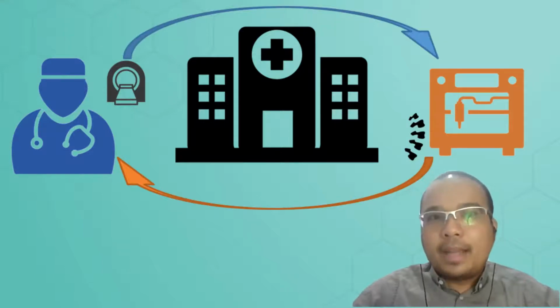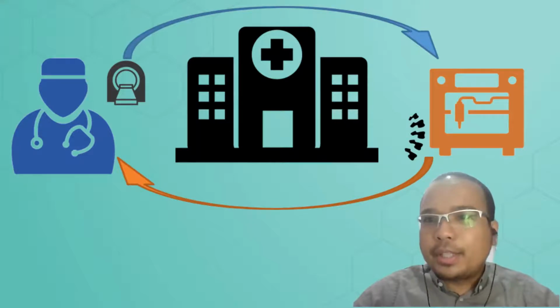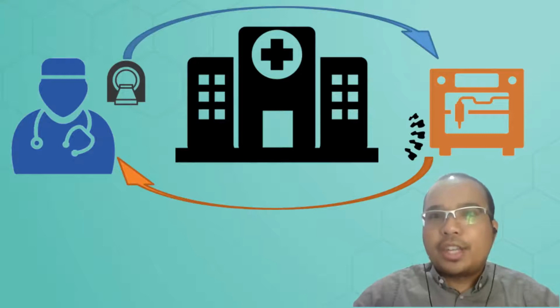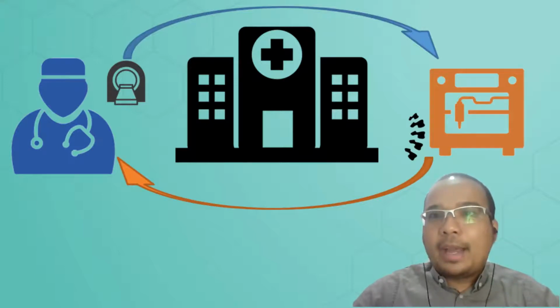Segment this on whatever the doctor wants, bones, tissues, skin, and manipulate this, prepare this to be 3D printed so that the doctor can just use the 3D printer on its own and come up with the anatomical model that he or she can use right away as a surgical guide or as part of the surgical planning process.